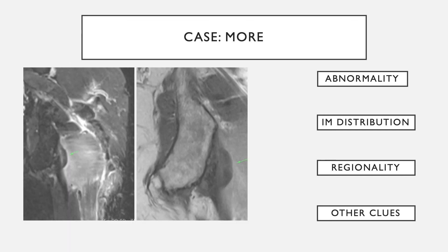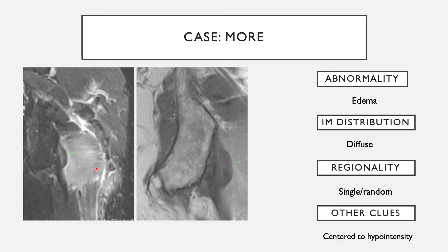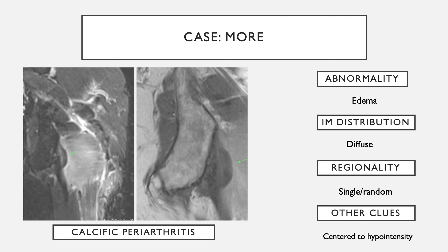In this case, there is diffuse muscle edema in the gluteal musculature involving a single muscle. Looking more carefully, everything seems to center on one particular area. When you see findings centering to one area, look carefully at that area. This ended up being an area of calcific periarthritis at the ischial tuberosity — this is an example of extensive muscle edema as a result of calcific periarthritis.